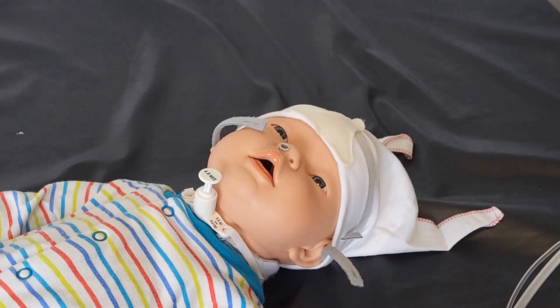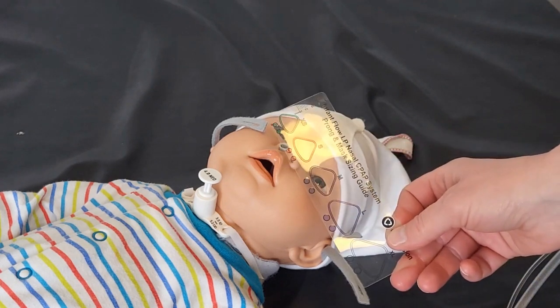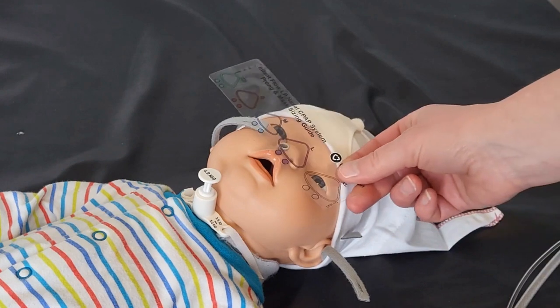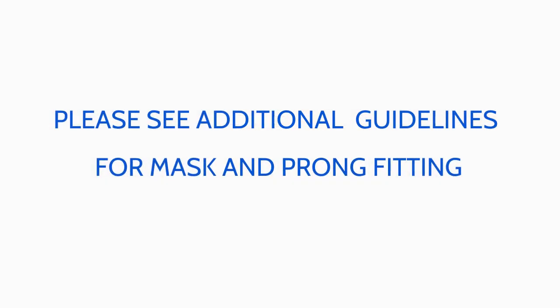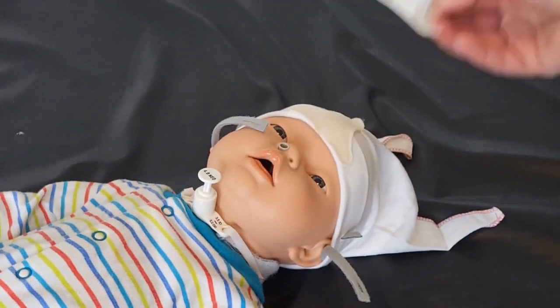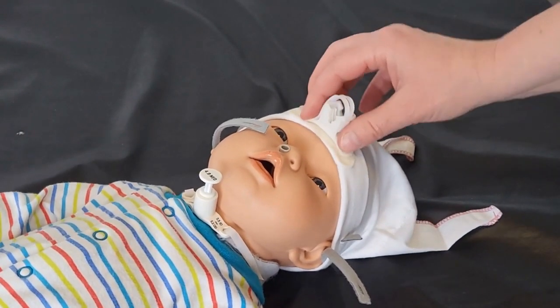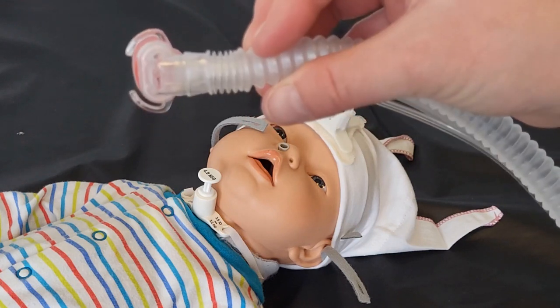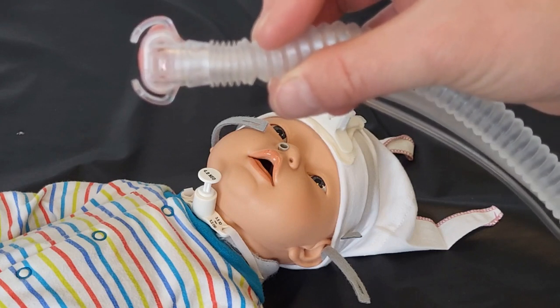Now you're ready to measure your patient for their nasal prong and nasal mask and fit your interface to start their CPAP treatment. Using the measuring guide that comes in your kit, measure the size of the nostrils and the correct size for the nasal mask. In this case, the patient has small nostrils for the nasal prong and between a large and a medium for a mask, so try a large first. Remove the Velcro T-piece from the end of the tubing and attach it to the bonnet so it's ready in place. Attach your mask to the end of the interface, and you can see the two hooks on the side that will hook to the holes in the ends of the straps.